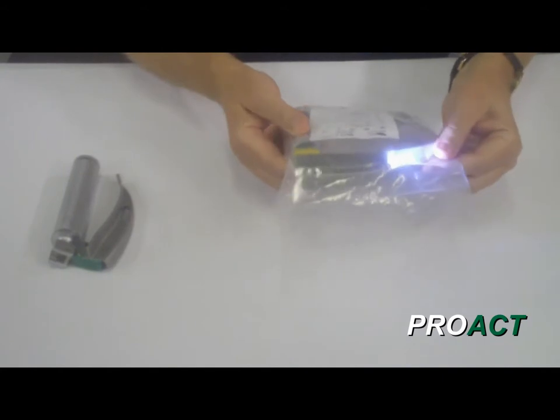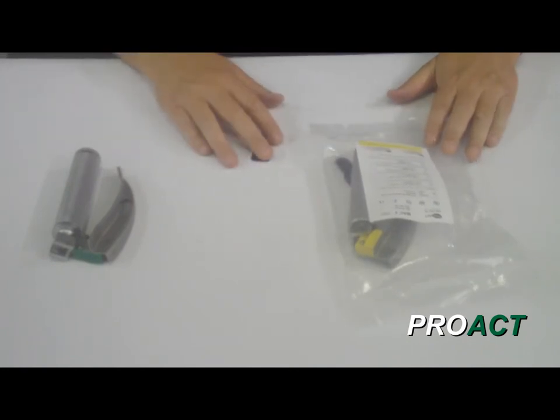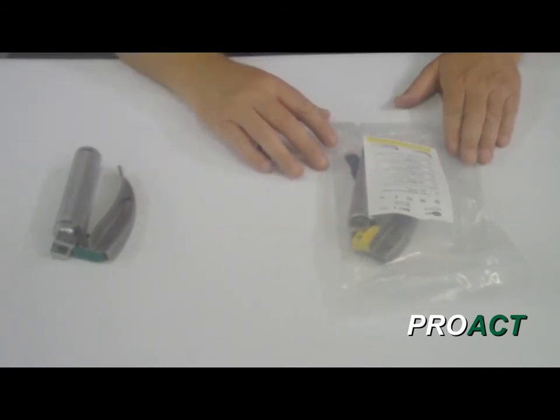So that's tested. I can go back. That's ready to be used. You can see the tab is in the bottom of the pack. It's been activated. We would recommend that whoever's looking after this trolley, when they activate it for the first time, they put a date on here and that the product is used within 12 months of that date.